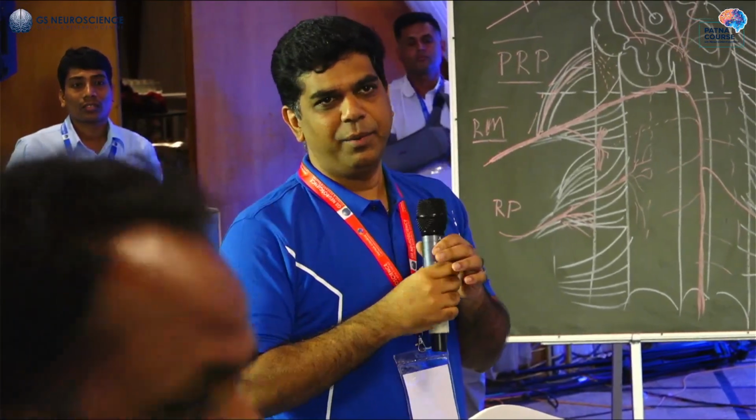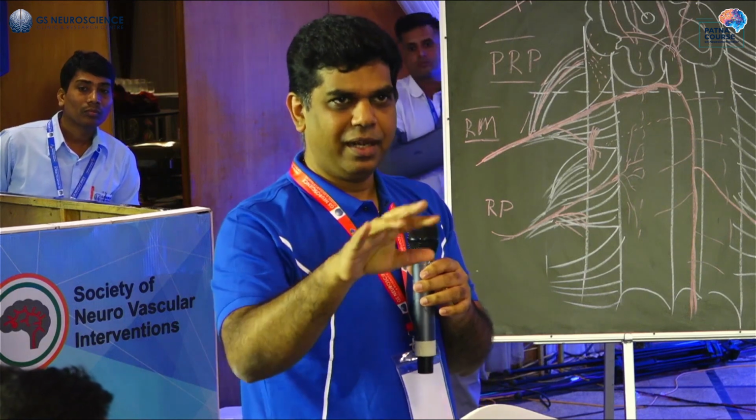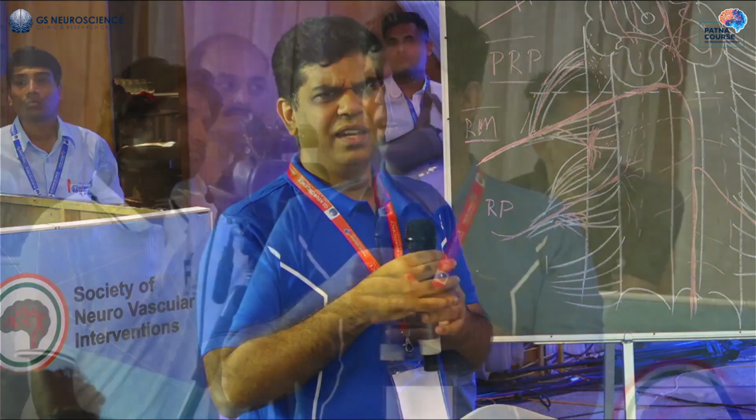The patient, I mean, practically after the angiogram, practically you have to make the patient prone. You're going to put this injectable coil on the muscle, close to the pedicle, just to localize the level, you know. That will remain there. Yeah, it will remain there. It's an, I mean, it's an implant, no?